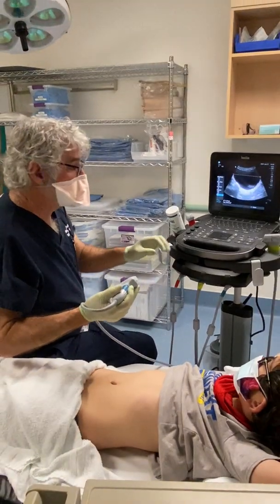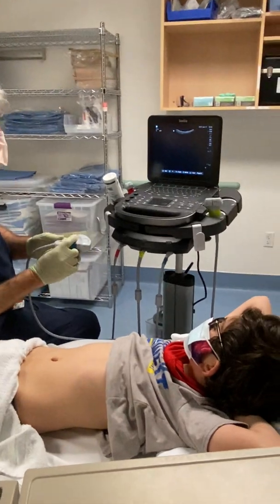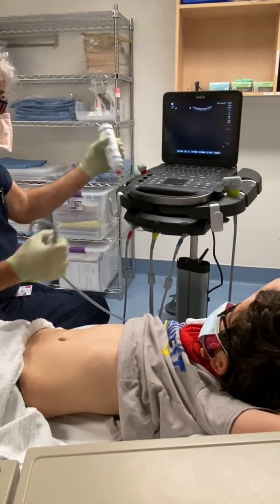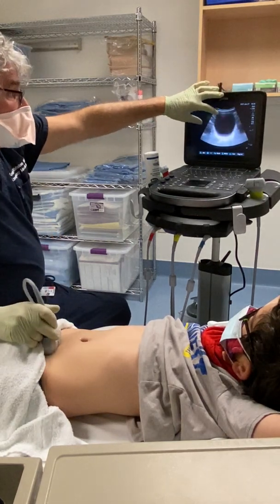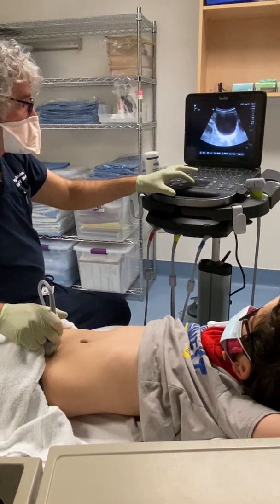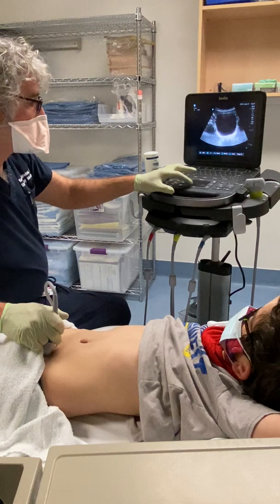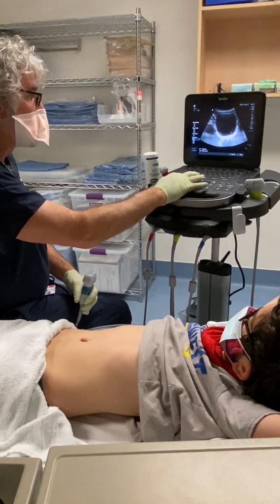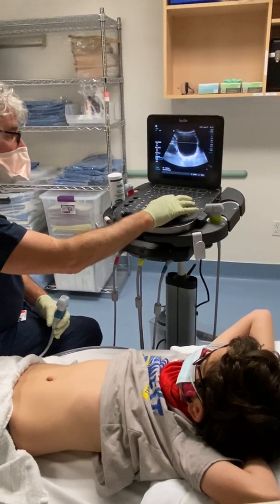There are a few ways you can easily go wrong. First, picking the wrong probe — you won't get the full view you want. Second, not using enough gel — the image might look really fuzzy, so put a little more gel on. Third, measuring the wrong part of the bladder — being too low or too high makes the bladder look really small, so get it where you have maximum dimensions. And a common mistake: you take the probe off and try to do your calcs, but there's no image because you forgot to freeze it. Go back and freeze it — almost everybody does that at some point. Freeze it, push CALC, pick your dimension, press calipers, measure, save calc, and do that in all three dimensions.